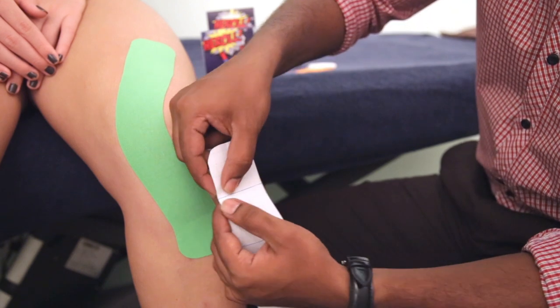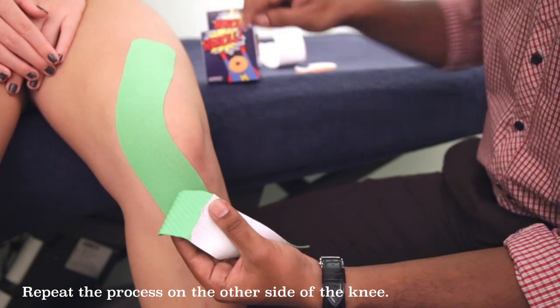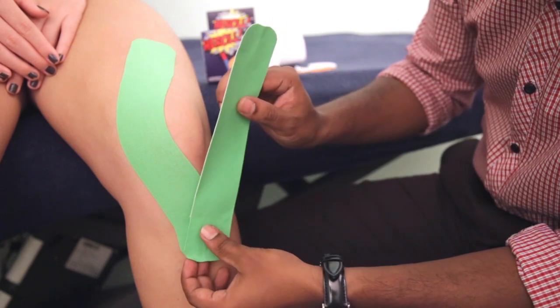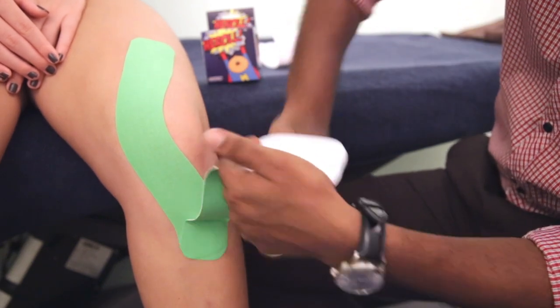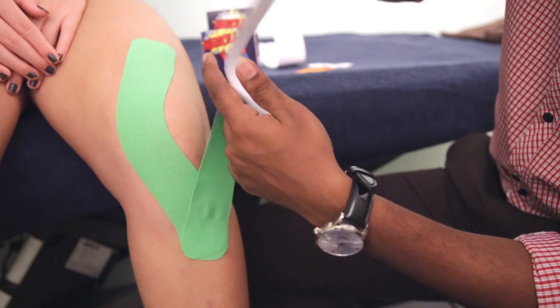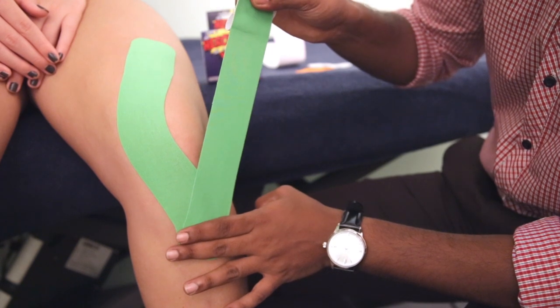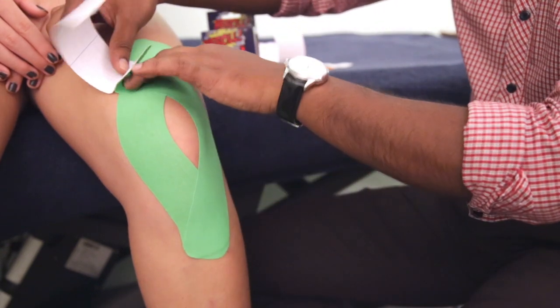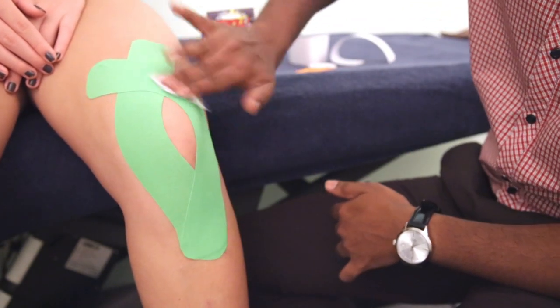Do the same for the other side. Peel off just one box. Make sure you don't touch the other side of the tape so that we don't lose the adhesiveness. Place right below the bony prominence, without any tension. Rub this down. On the other side, peel everything off again and you will be left with one box. Pull it to 100%, back to about 50%, and surround the other side of the kneecap all the way to the top. Place it down and relax on the anchor again. Rub it down as well.